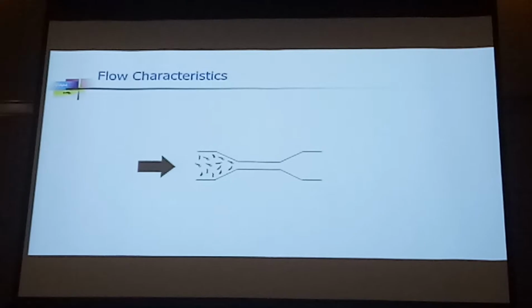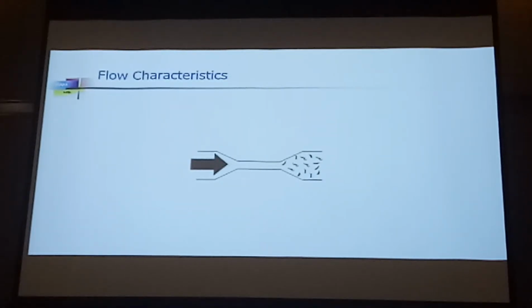So just to illustrate, the OVD generally are like spaghetti or spring coiled up, entangled. They are not individual, they are entangled. So they can behave very cohesively, very solidly. When you apply pressure initially, there is resistance, but once you push a little bit further and faster, the spring uncoils as shown here, and then suddenly they give and go through a narrow channel.